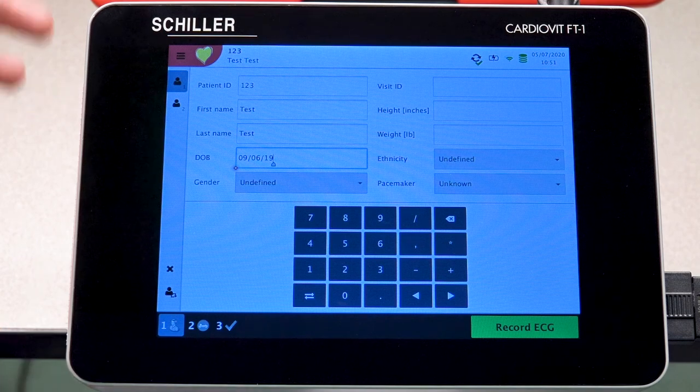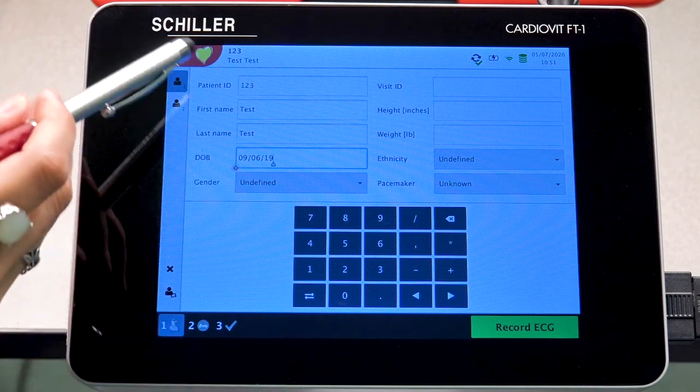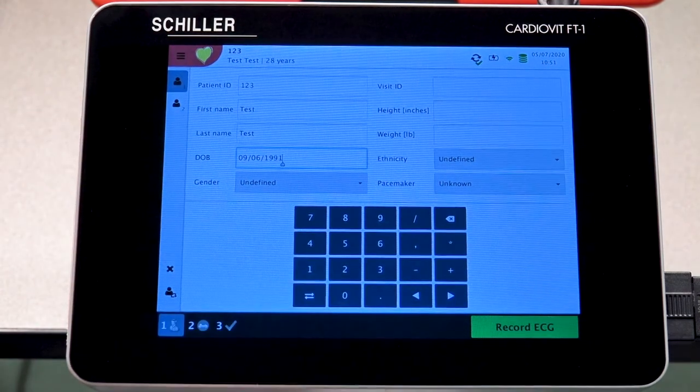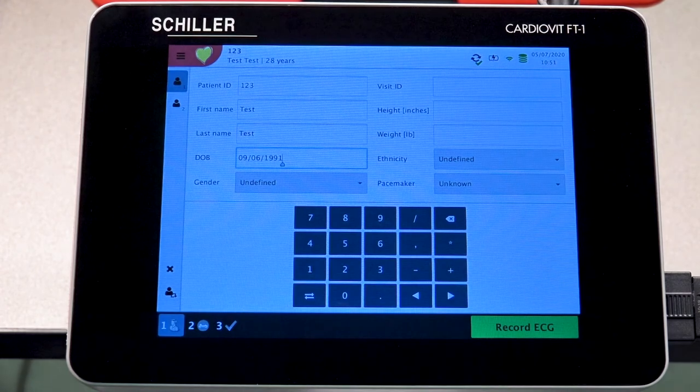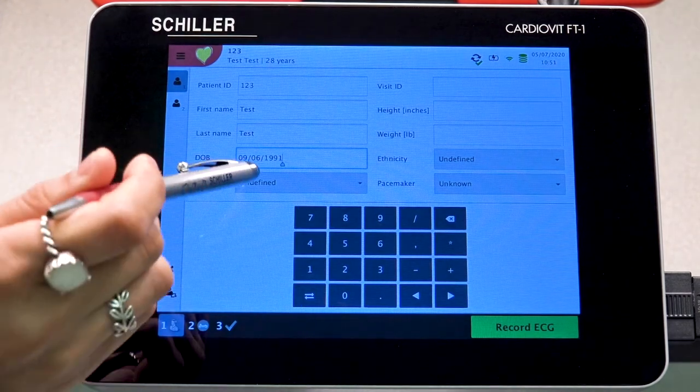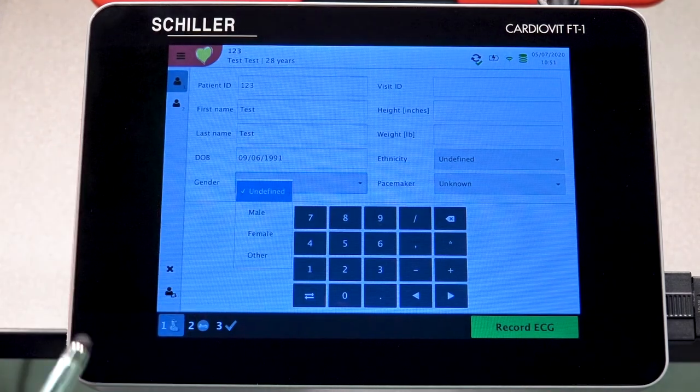Before moving forward, just ensure that everything is entered properly. In the following field, you will be able to select your patient's gender.